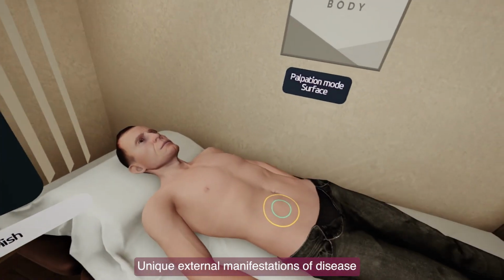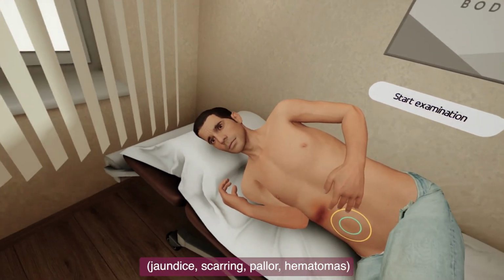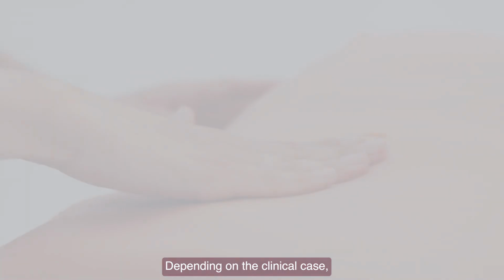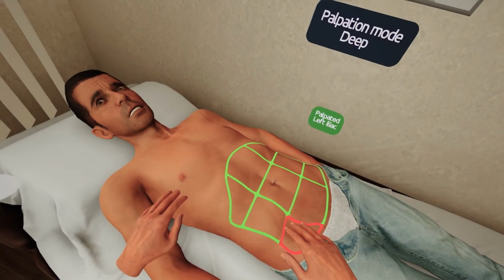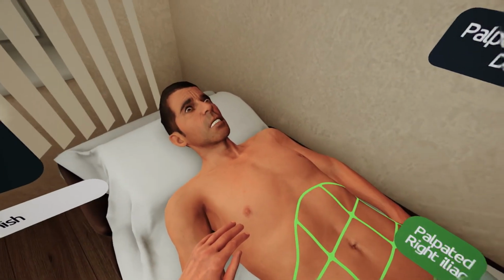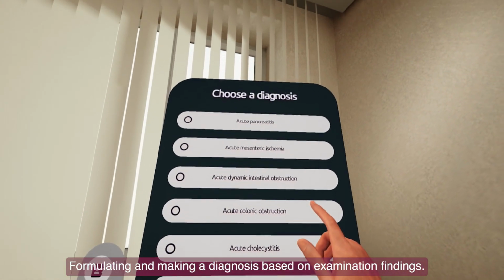Unique external manifestations of disease, jaundice, scarring, pallor, hematomas. Depending on the clinical case, different degrees of patient pain reaction to palpation in certain areas. Formulating and making a diagnosis based on examination findings.